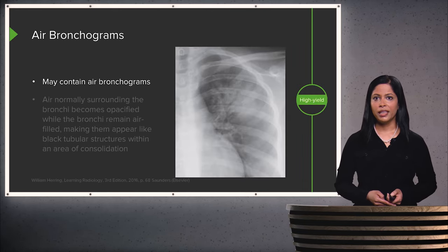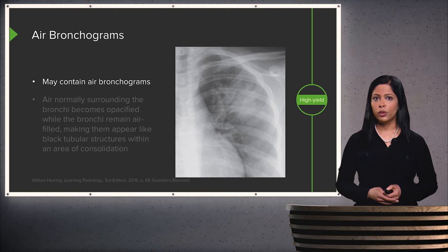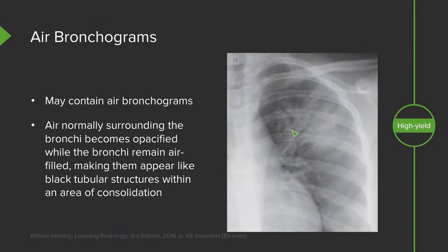Let's go over some signs of consolidation. When you have an area of consolidation, it appears white on a chest x-ray and may contain what we call air bronchograms. The air that normally surrounds the bronchi becomes opacified and appears white, while the bronchi remain air-filled, making them appear as black tubular structures within the consolidation. This area in the left upper lobe shows those linear black tubular structures representing air bronchograms — one of the key features of consolidation.